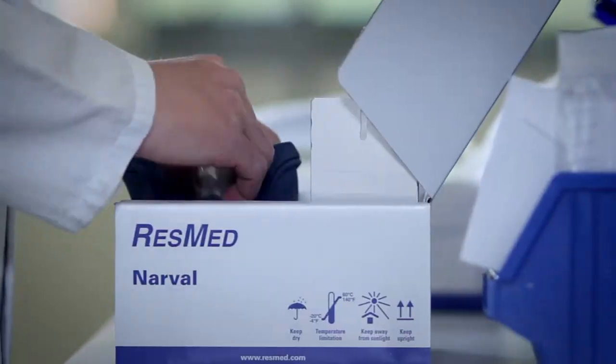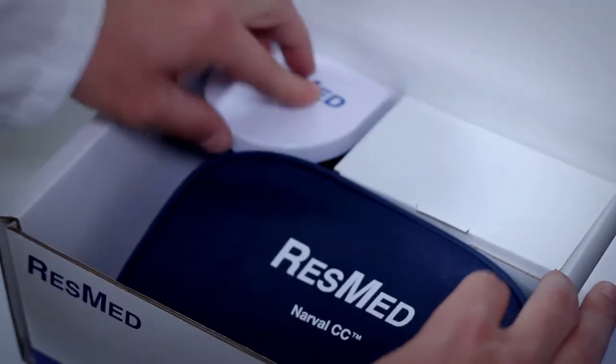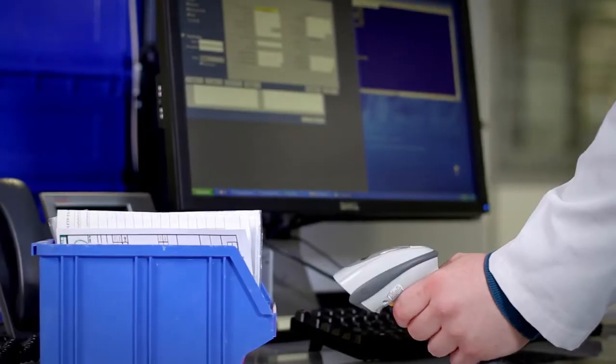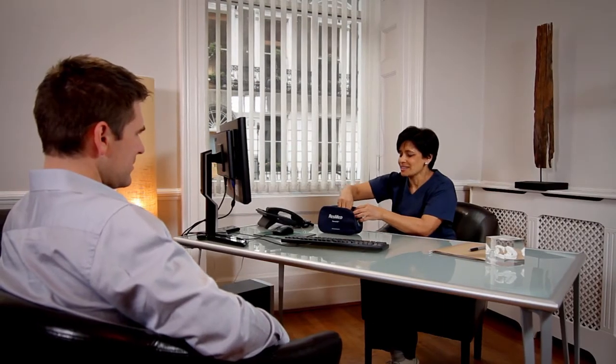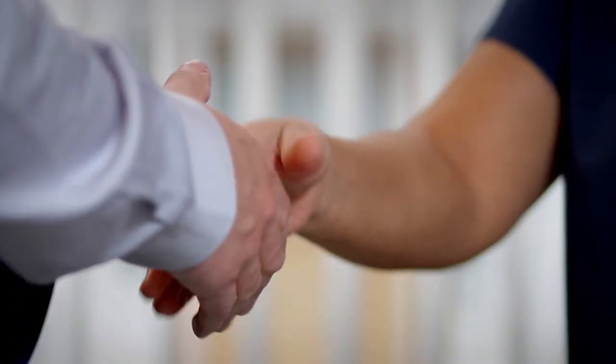The device will now be prepared for shipping, where it will be packed and all of your details checked again. And it will be dispatched to you, so you can supply it to your patient.